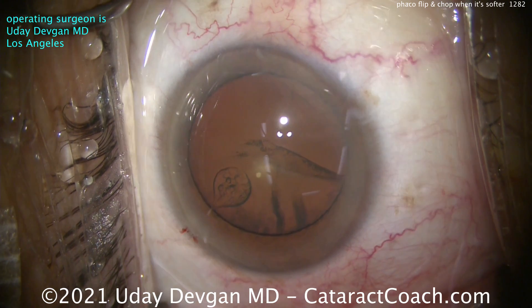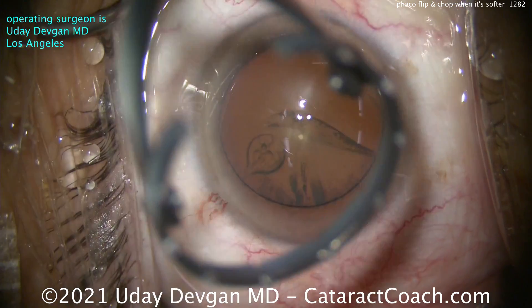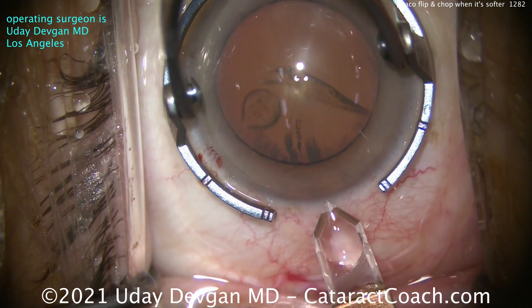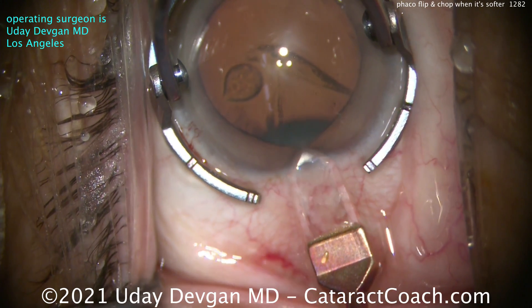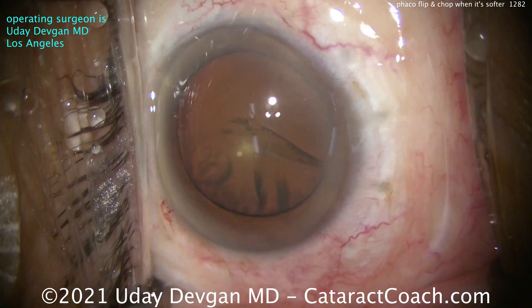There's a good fill of our dispersive viscoelastic, and we're making the main incision again. This was done on the same day as the previous case. Using a diamond keratome here — barely nicked those limbal vessels, just barely. Nice single plane incision; tunnel length looks pretty good. I love those diamonds.